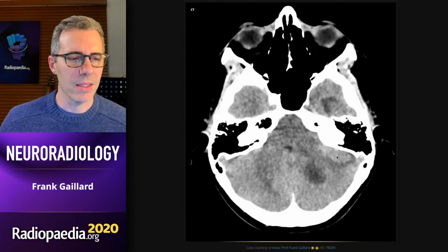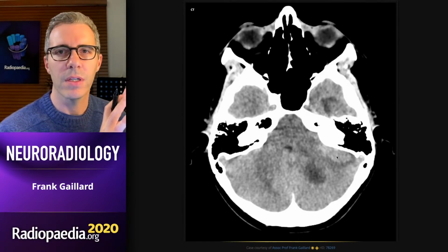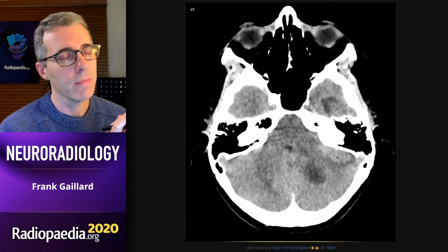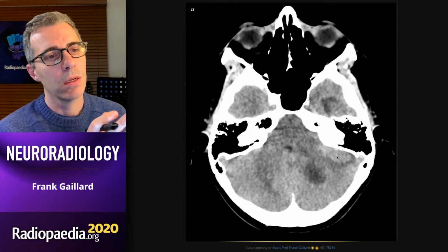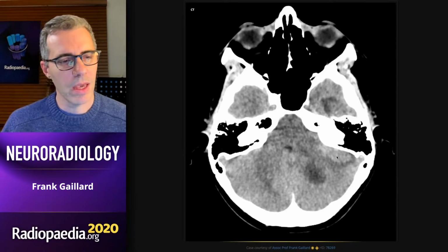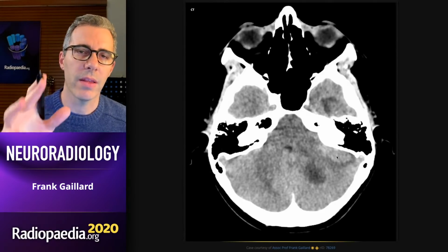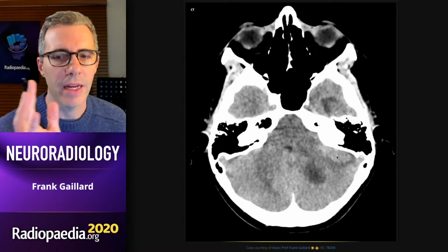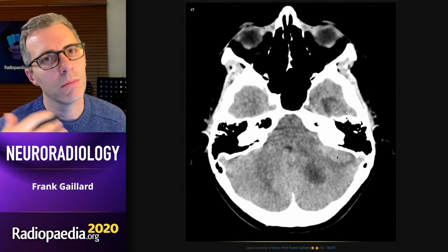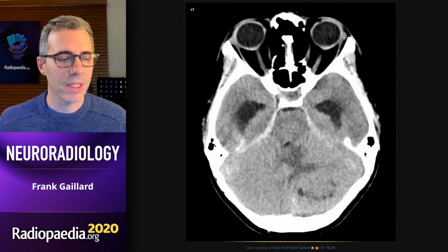When you think about things that are hyperdense on CT, what do you have? You've got meningioma, and that's because either they're very fibrous and highly cellular in a non-aggressive kind of way, just in a swirly, compact kind of way, or they have psammoma bodies, which can increase the density because they're microscopic flecks of calcium spread throughout the tumor. Hemorrhage can be hyperdense, but this doesn't really look like hemorrhage. And highly cellular tumors, just like they depress ADC values, can also elevate CT values. And so we're looking at small round blue cell tumors, lymphoma, medulloblastoma, pineoblastoma, etc. We're not seeing very much else, so let's move on to a real test.